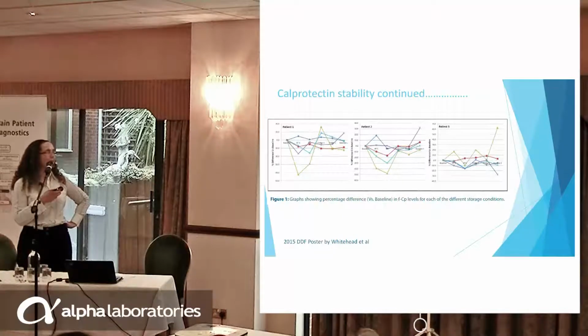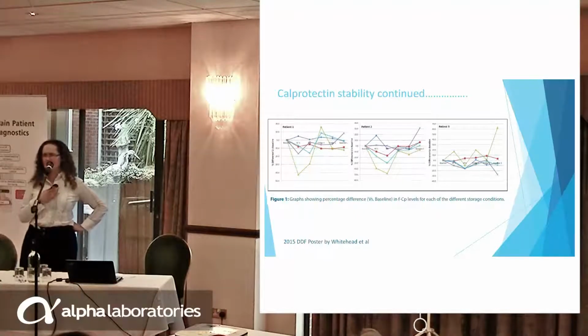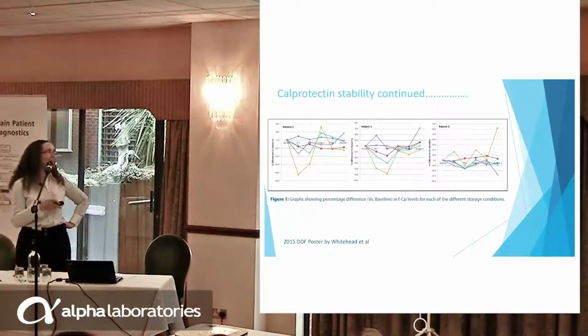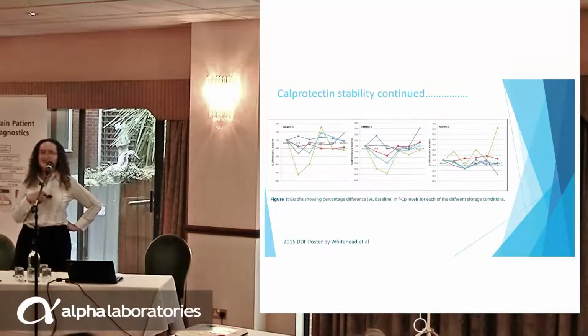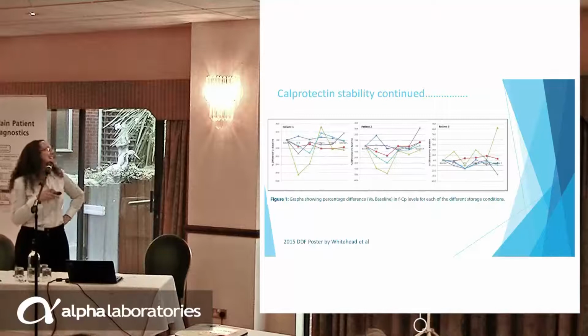They ensured that they were homogeneously mixed by sacrificing some kitchen blenders. They then stored them in the fridge and at ambient for 7 and 14 days, and then they pushed them out through the EQA scheme. You lucky people getting that.